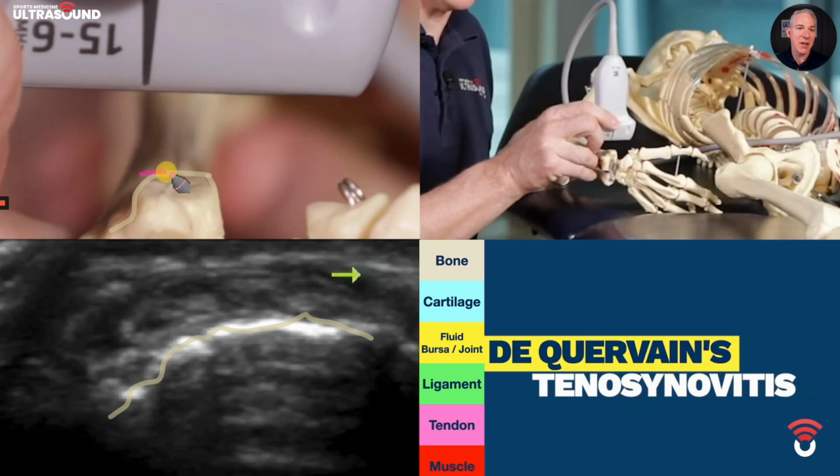So we know the tendon's going to be sitting here above the bone. So that makes it easier to say, well, the skin's up here somewhere. So this is essentially all tendinous tissue here. There's a little bit of muscle sitting over here, but that's it. Why don't we just draw that in for being thorough? Because this isn't actually fluid, it's actually muscle.